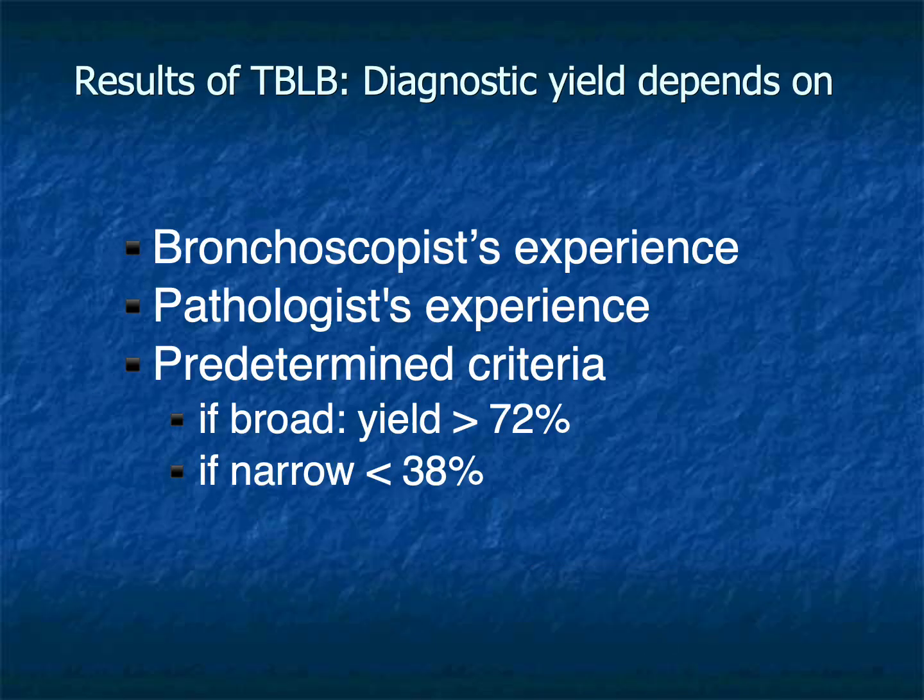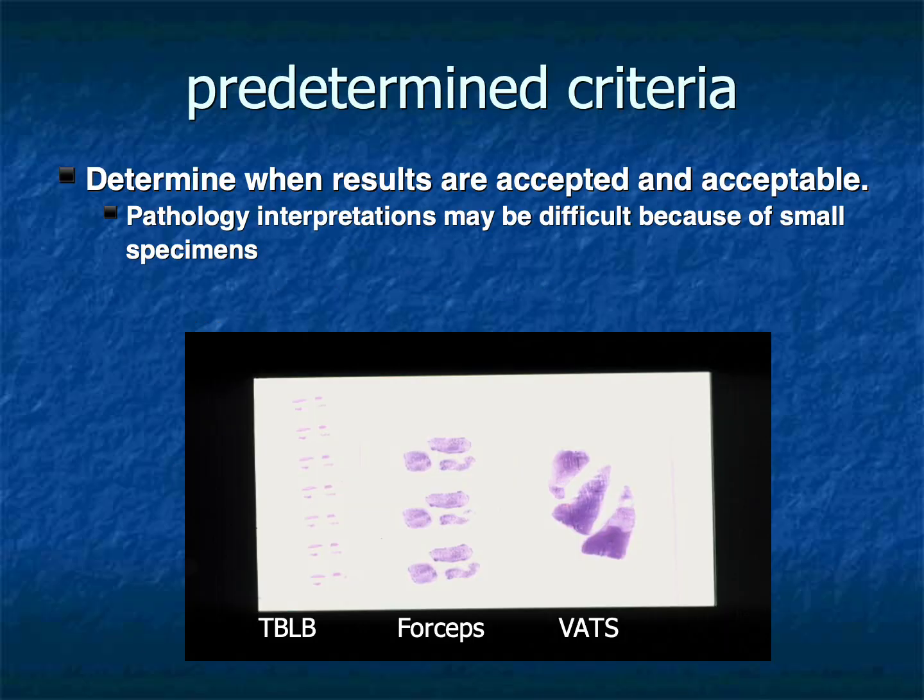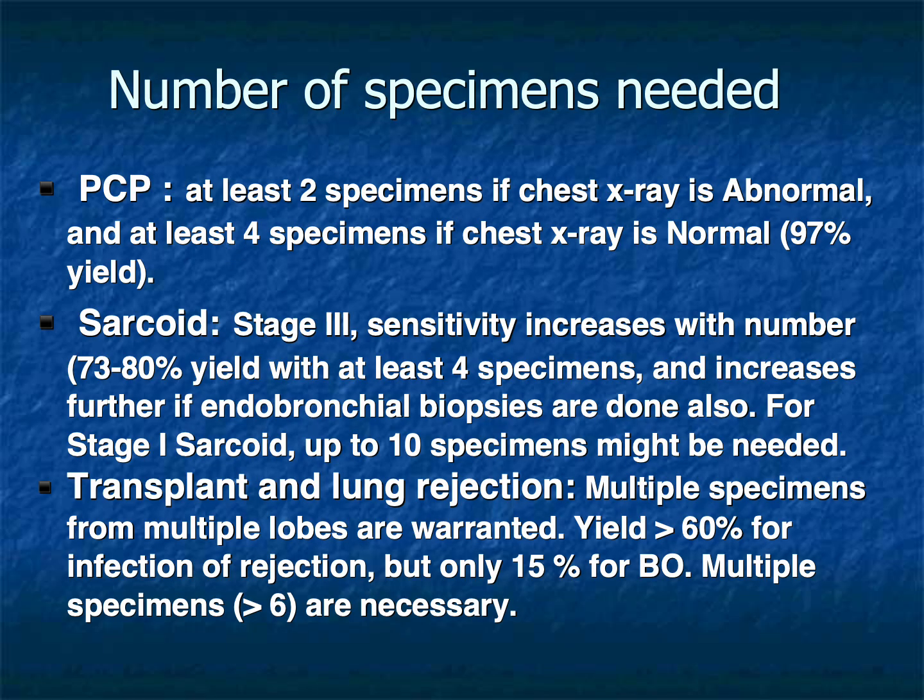The diagnostic yield of transbronchial biopsy depends upon many variables: operator experience, pathology expertise, disease process, specimen size, number of biopsies obtained, and predetermined diagnostic criteria all influence results. Sample size remains debatable. Results have changed over the years and frequently improve when cryobiopsies are obtained using cryotherapy. Years ago, there was a lot of debate about numbers of specimens and differential expected yields according to suspected disease processes.